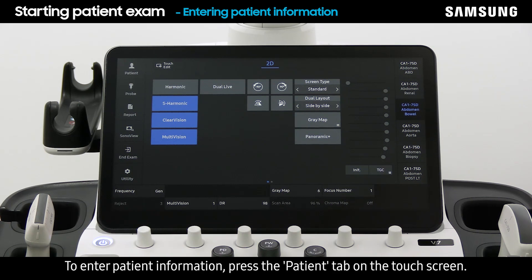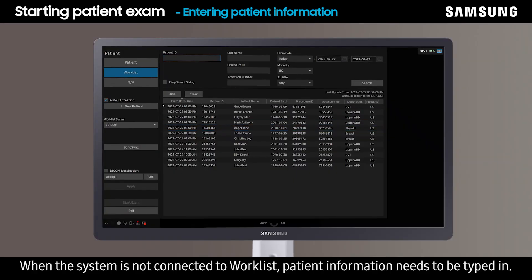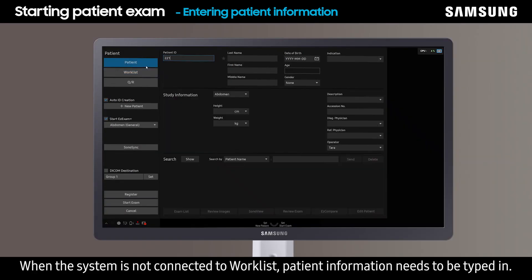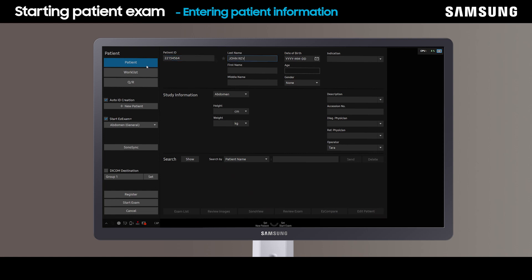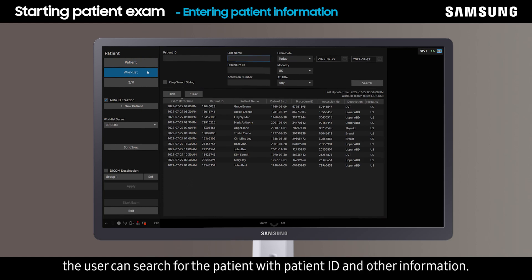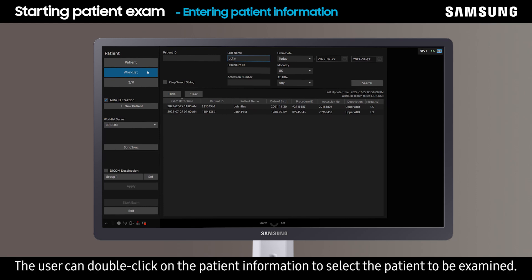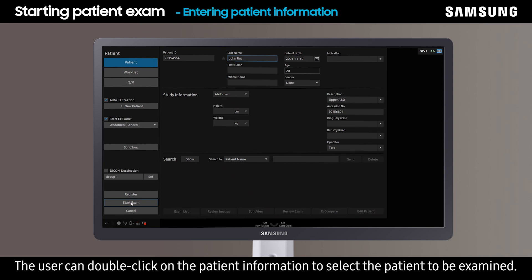To enter patient information, press the patient tab on the touch screen. When the system is not connected to Worklist, patient information needs to be typed in. When the system is connected to Worklist, the user can search for the patient with patient ID and other information. The user can double click on the patient information to select the patient to be examined.